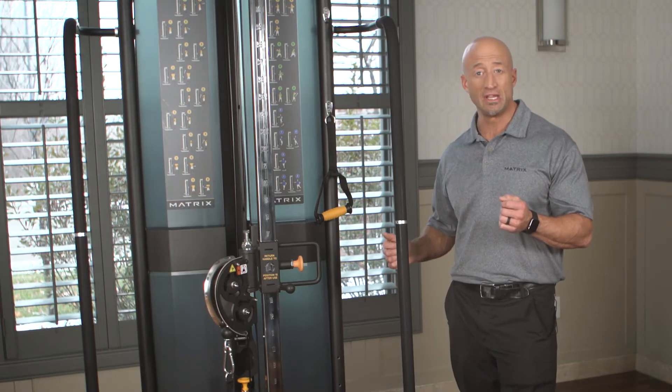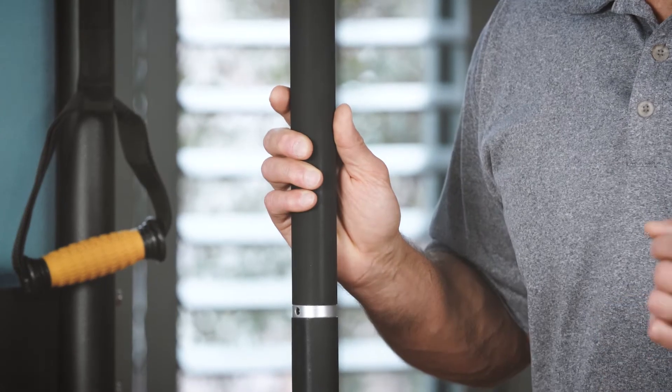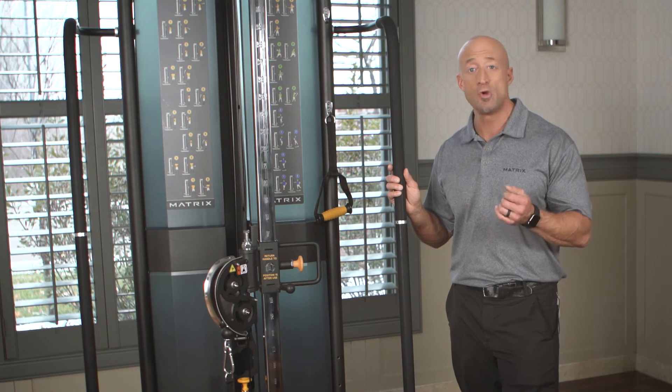With options that come on the machine, like these medical handrails, you have additional areas for support and stability during more challenging exercises or with people who have balance issues.